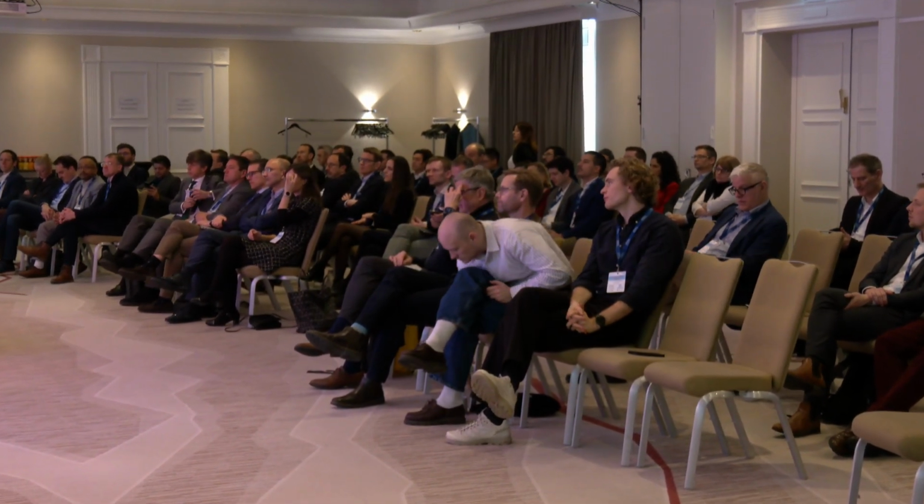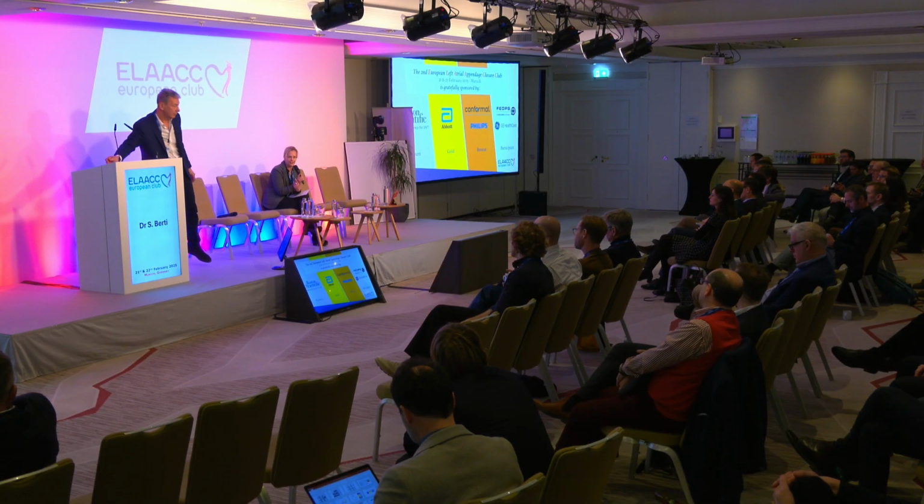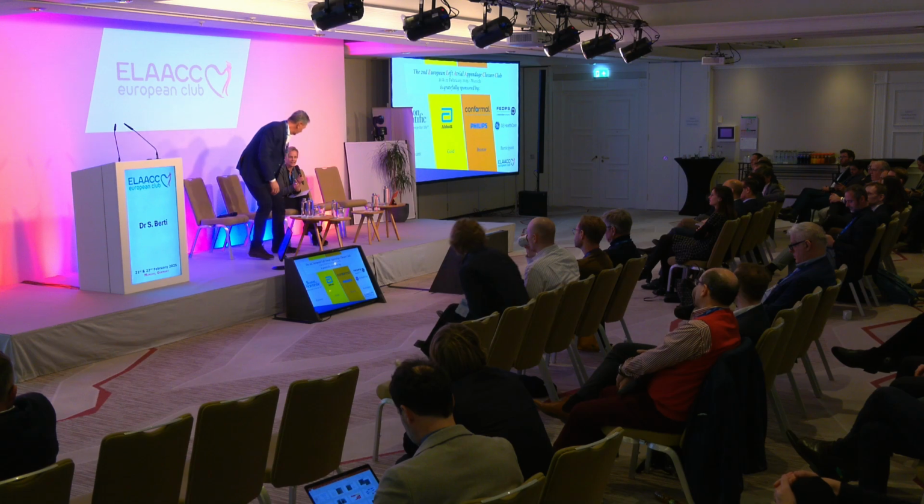I mean, Sergio, we might go deeper into the discussion after we've seen some cases from Jens-Erik. So Jens-Erik, if you would come up. But one question, Sergio, who's handling the ICE probe and who's handling the echo machine?